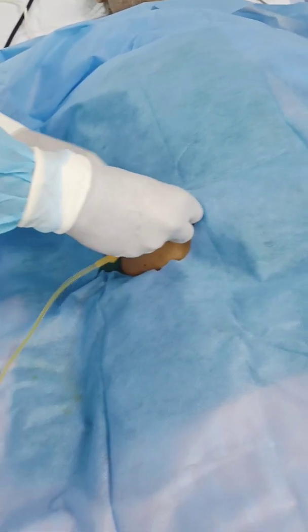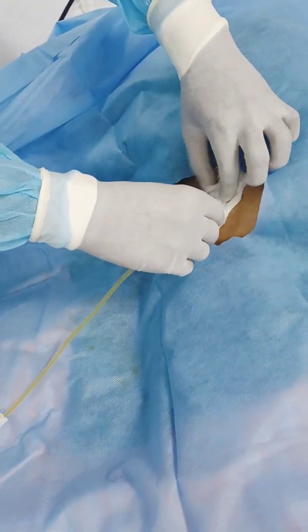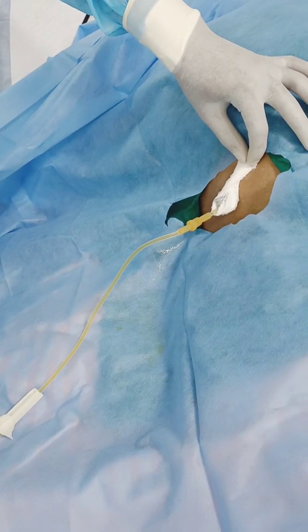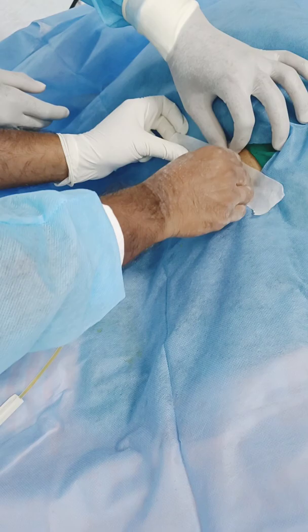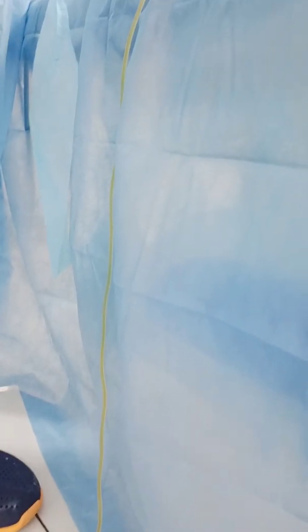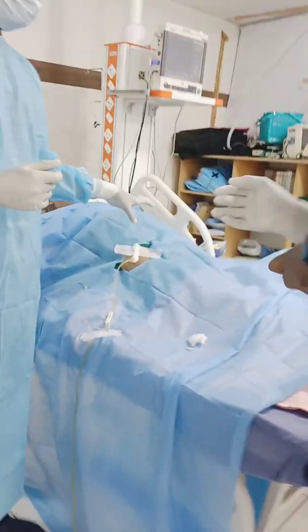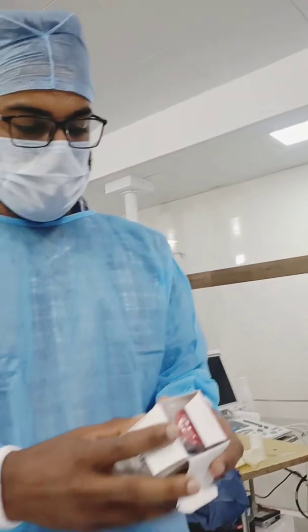Using a sterile gauze piece, I am lifting the cannula and fixing it with paper tape so that the cannula won't come out as the patient moves. We will leave it there for another 15–20 minutes, and the ascitic fluid keeps on draining into the jug. In the end we will measure it.